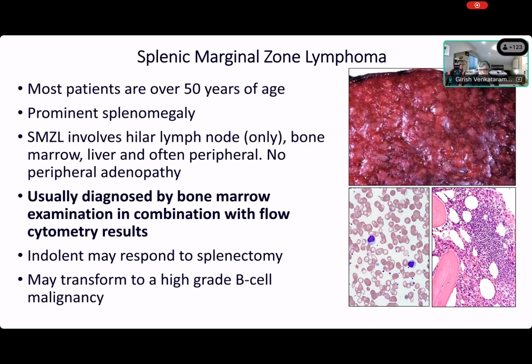That's an important thing. But now we're talking about marginal zone lymphoma. So look at that picture. And on the right side, there's a bone marrow biopsy, because the bone marrow biopsy is much easier for people to do rather than a splenic biopsy. So they go poke the bone marrow and you find some infiltrates, right? Those don't look paratrabecular and they don't look entirely sinusoidal either. They look interstitial.